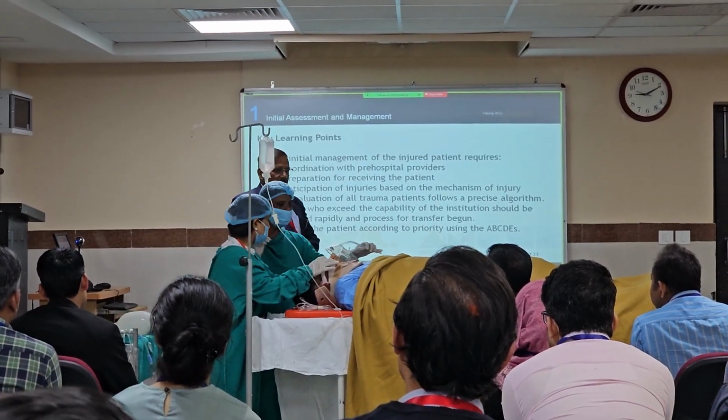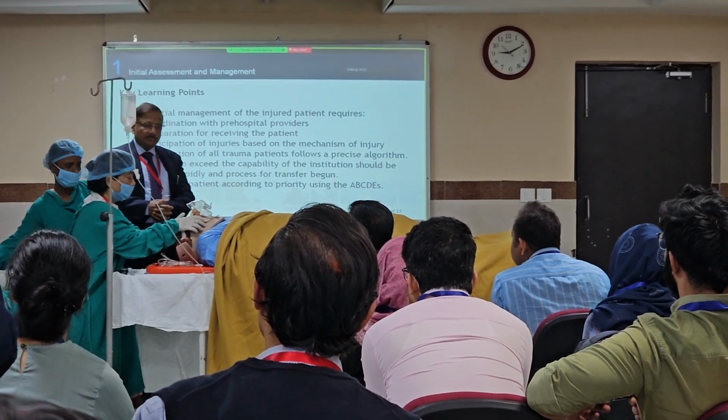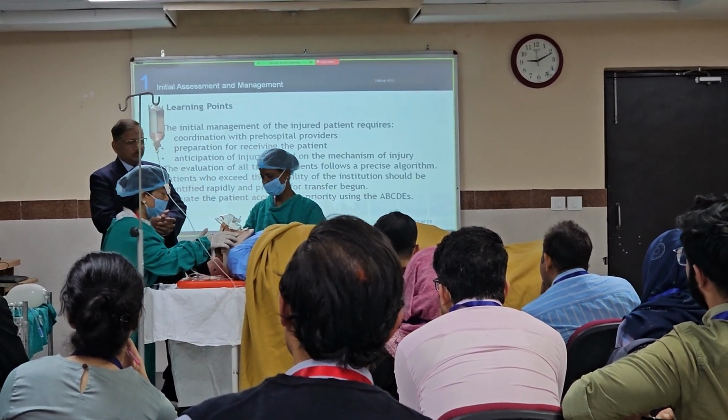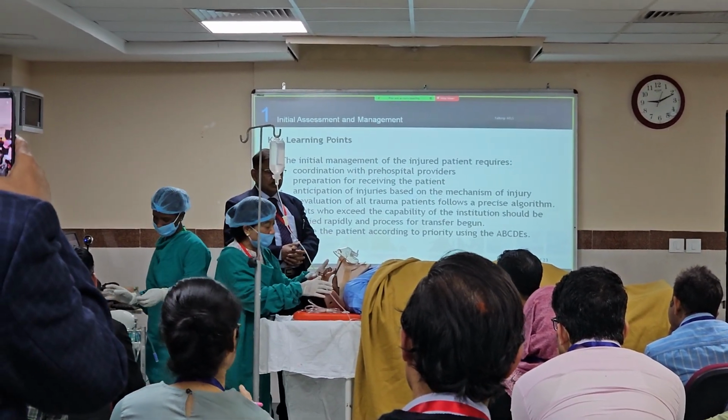What do you want to know in the monitor? So we need to know the saturation. Saturation is 82%. Okay, right. And did this suction help in the saturation improvement? No, sir, not at all. Okay. So anyway, sister, please get me the intubation ready.